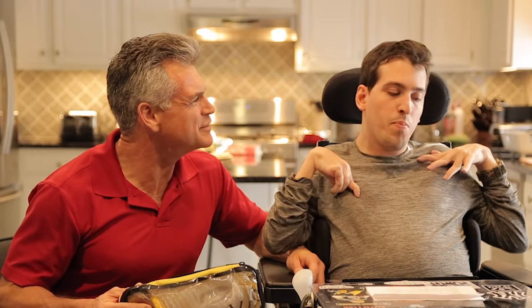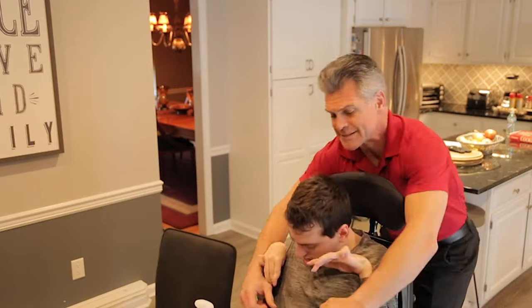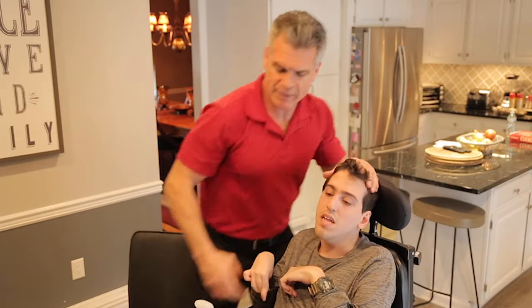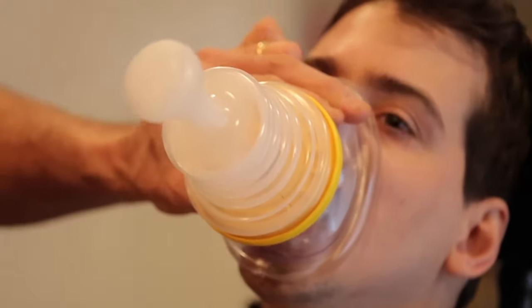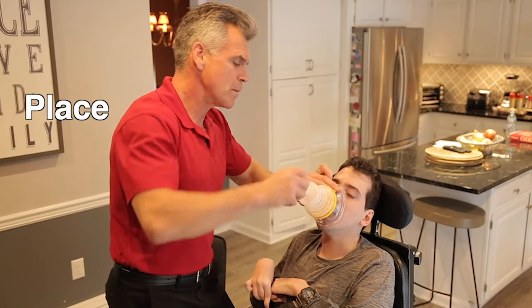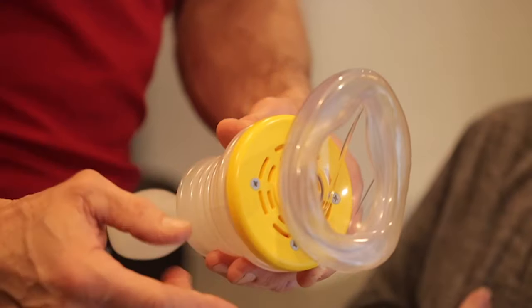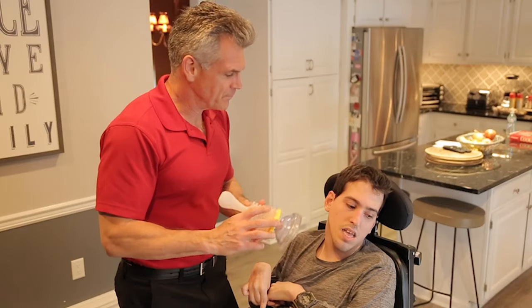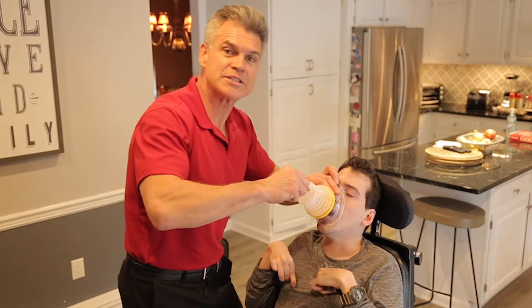Should we show them how it works, Anthony? First, I notice Anthony is choking. I then position myself behind Anthony and attempt abdominal thrusts. If unable or unsuccessful, I'll tilt his head back and place the LifeVac over his mouth and nose. Holding the mask with one hand and with my dominant hand, I'll push down and swiftly pull up. It's as easy as place, push, pull. Because of the one-way valve, when I push down, air goes out these side vents, so the only airflow is out of his throat. I'll check for the object and for breathing. If necessary, I'll place, push and pull again.